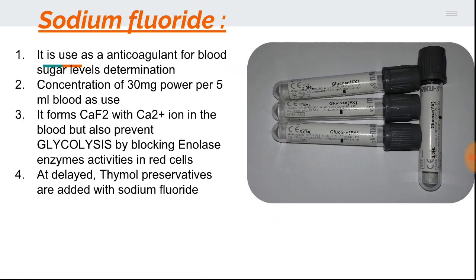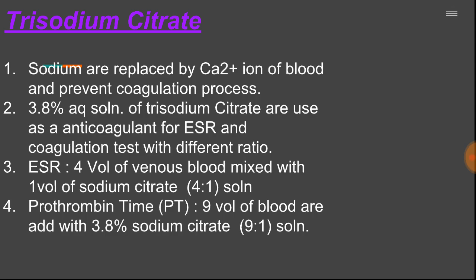Here, the sodium oxalate is used as an anticoagulant, and the sodium fluoride acts as an antiglycolytic agent. Next, trisodium citrate. Sodium is replaced by the calcium ion in the blood, which prevents the coagulation process.